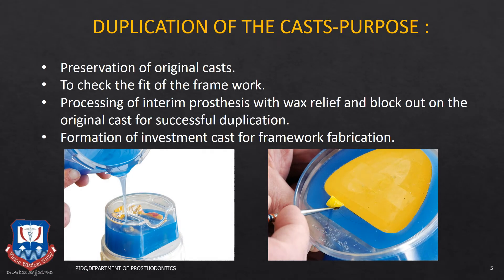Before we go any further, the master cast is duplicated in order to ensure that if there is any damage, the work is not lost. So after surveying of the diagnostic cast and surveying of the master cast, the master cast is duplicated using either a hydrocolloid impression material like agar agar, or using a room temperature vulcanizing silicone also known as RTV silicones. This is then poured in an investment material of choice, usually a type 4 or type 5 investment material.